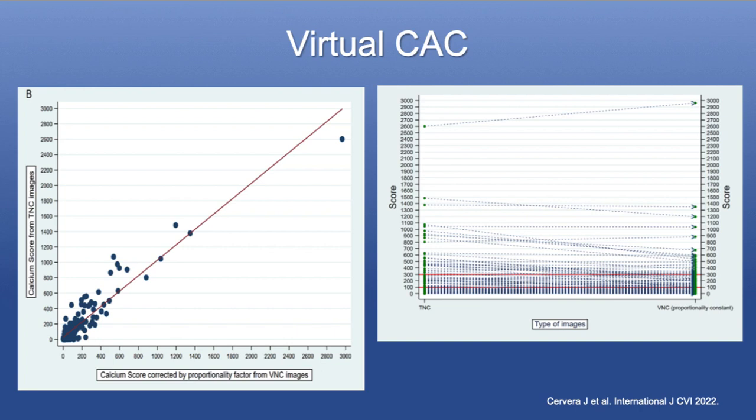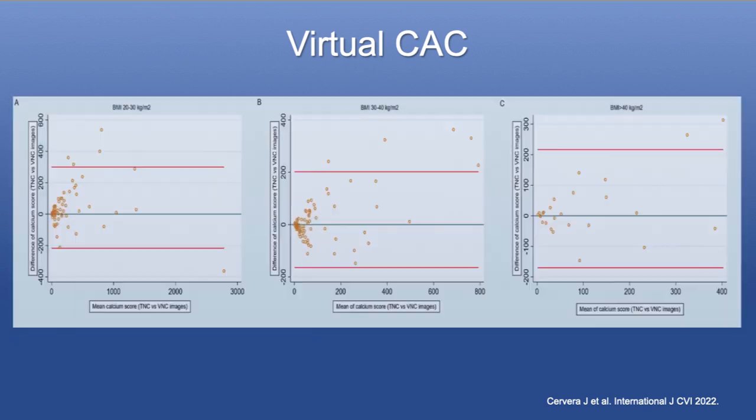And we can see here the changes between the traditional non-contrast score on the left here and versus on the right. Most of them stay within the same category. The ones that are more challenging, I think, are the ones that have a low traditional non-contrast calcium score, if it's 10 or 5, those may be missed. But the ones that are really important for the preventive therapies and they have the higher risk, the ones that have over 400, in particular, remain within the same range.